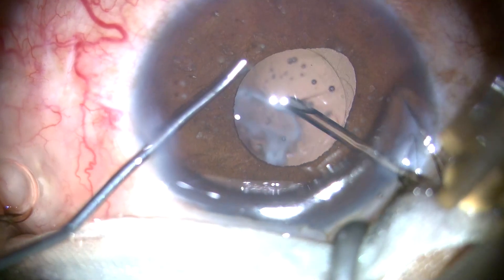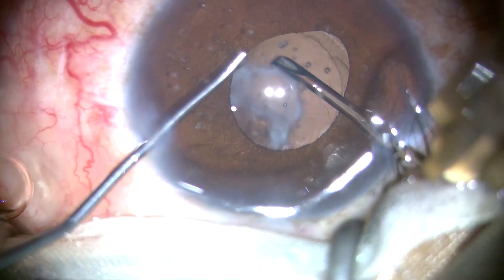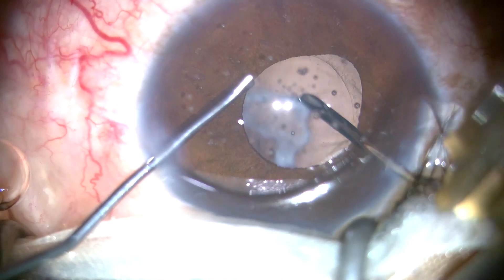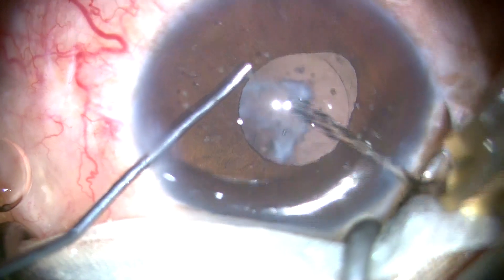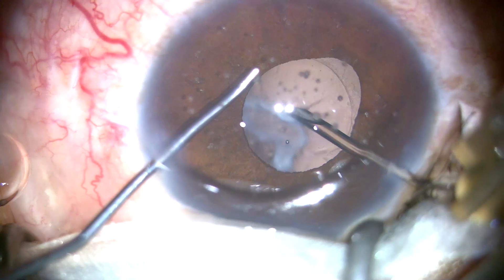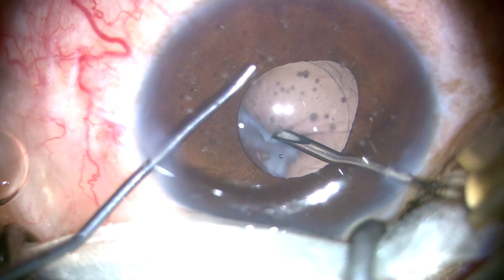Let me try to scrape it off the posterior capsule. Let me try this capsulotomy — in case I can't scrape it off, I will puncture the posterior capsule and do a posterior capsulorhexis.